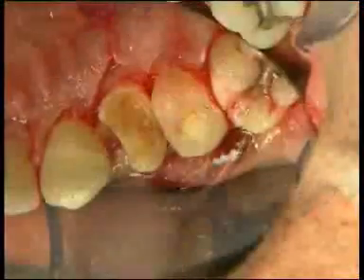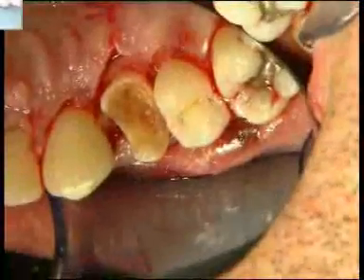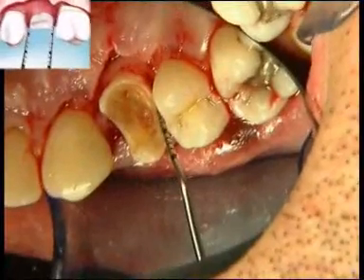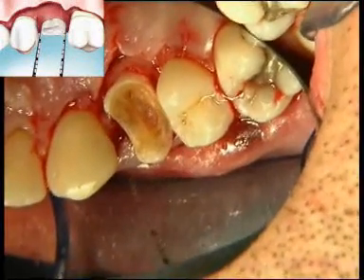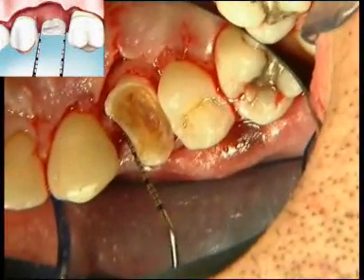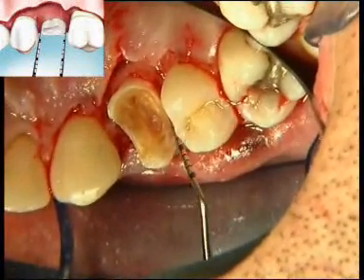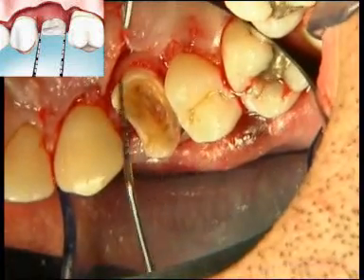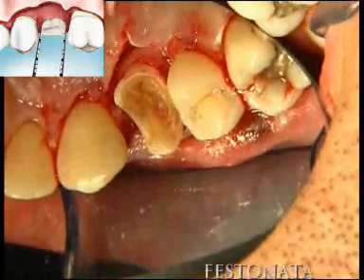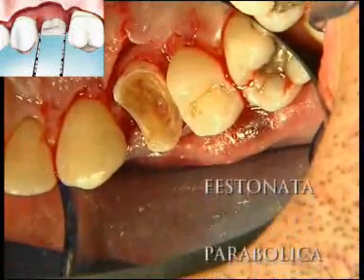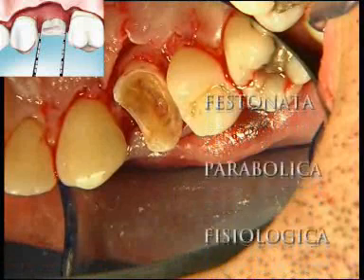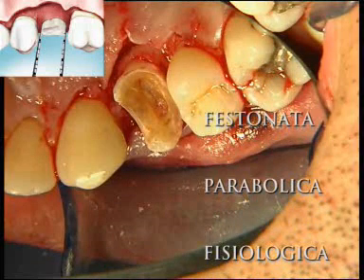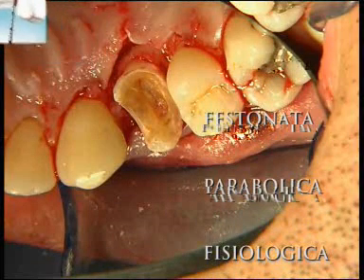This ostectomy produces the desired osseous architecture — scalloped, parabolic, and physiological. A universal curette may be used to eliminate small interproximal spicules of bone, which could subsequently compromise the desired outcome.